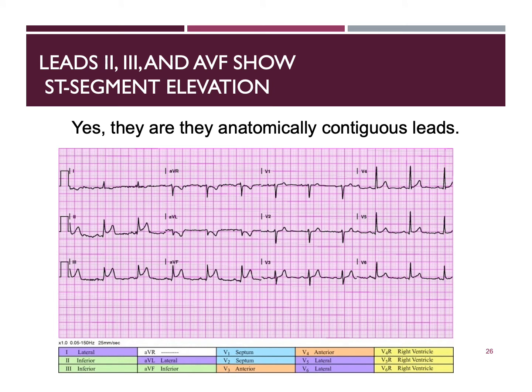So this ECG does in fact show ST segment elevation of more than 1 millimeter in leads 2, 3, and aVF. So an inferior wall infarction is suspected to be the cause of the ST segment elevation. We are also seeing that they are anatomically contiguous leads.